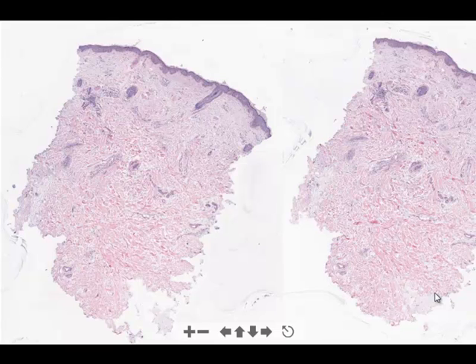The first slide that we're going to examine today is located in your slide library. If you look along the left-hand side of your screen, you'll see a category named Interface and Lichenoid Reaction Patterns. Click the drop-down button on the left-hand side, and the first diagnostic category you'll come to is Dermatomyositis. The slide which we will review is the first slide in this category.